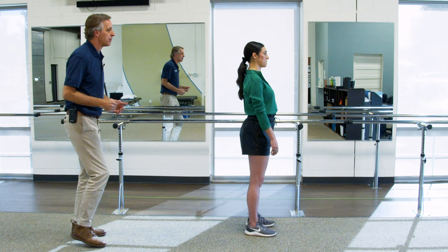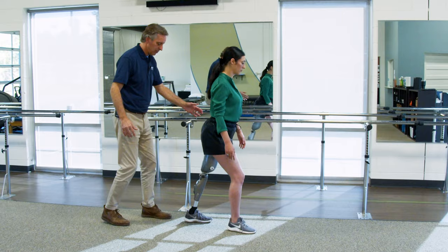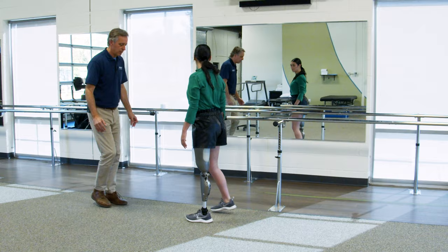So all I want you to do, Tracy, with either foot first, is step back. There you go. Keep your weight more on the forefoot of the prosthetic and keep stepping a little bit shorter and wider. A little bit shorter. Oh, not that wide. There you go. A little bit shorter and wider and just keep coming with both feet. There you go. Keep coming. That's it. Perfect. Turn around. Same thing going back, just a little bit shorter and wider, it doesn't have to be huge. There you go, boom, boom, boom.